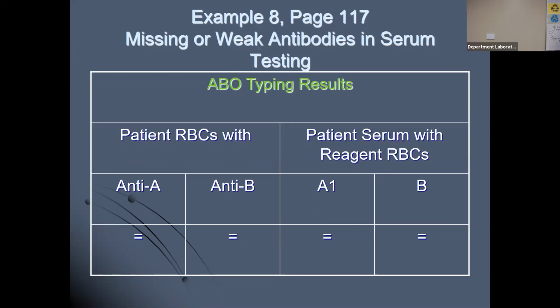your back type, okay? So the first thing you want to do with this guy, he has very weak ABO antibodies reacting in his plasma. If you guys don't know this already, you could actually enhance the reaction of IgM antibodies by cooling them, all right? So you could incubate these tubes at 4 degrees for 15, 30 minutes, and then recentrifuge them for agglutination. Okay, that cold temperature enhances an IgM antibody. It could make these reactions what we call pop out. It can make them go positive.